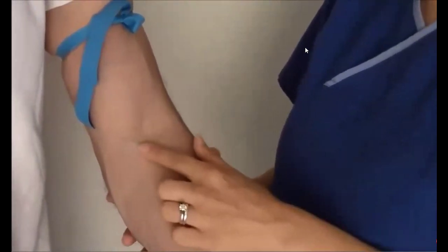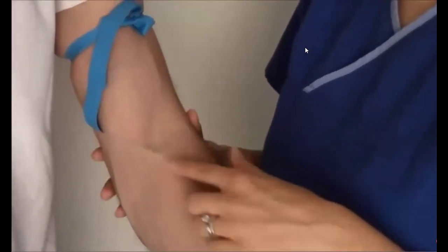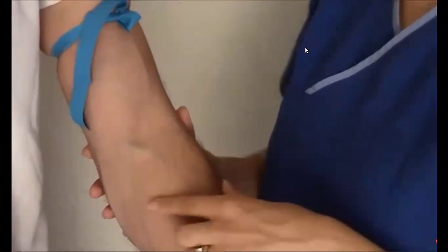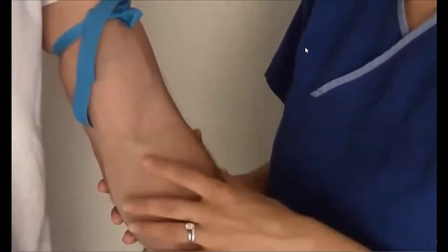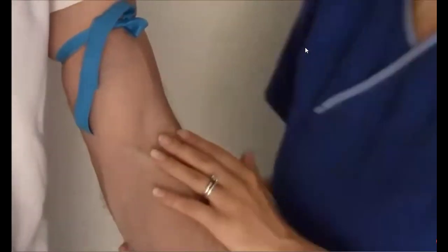So if you're new to starting IVs, I really recommend you practice on yourself with feeling your veins. Put a tourniquet on and just feel your veins. Get a feeling for them, because once you understand how they feel, you'll know whether you're feeling a vein or not. That was the biggest thing whenever I was a student. I would always say, am I feeling a vein? Is that a vein? But now I know without a doubt, because I have it down so well of how a vein feels. So that's your AC region.